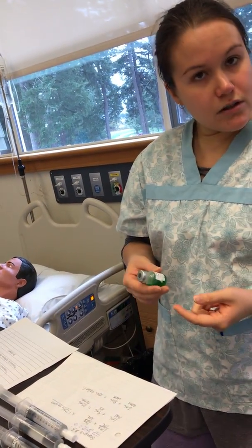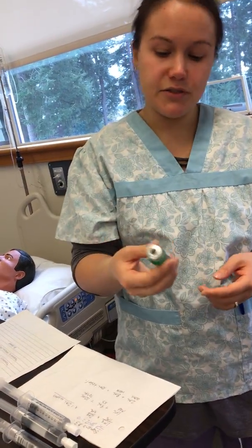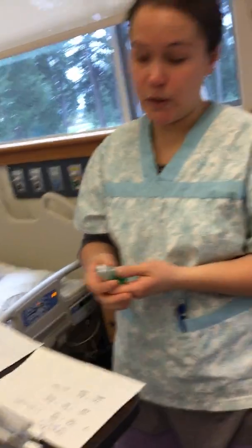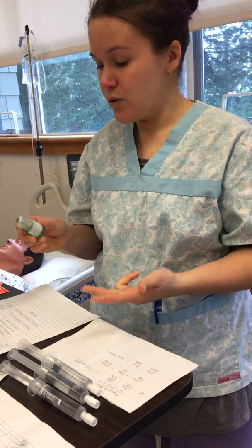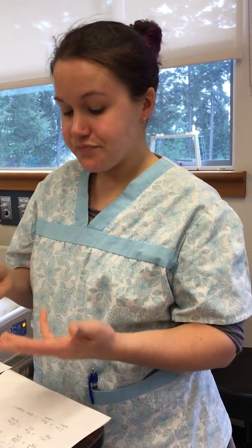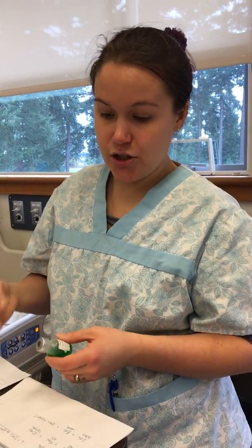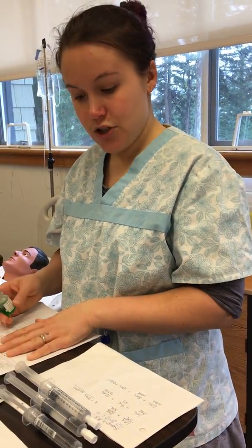It should be an ampule, but there's no more ampules left in the Learning Center, so I'm using a multi-dose vial instead. So we're going to pretend it's an ampule. As I take it out, I do my first set of checks, 7 rights. Patient, Sue Brown. Drug, morphine. Dose, she's going to have 2 milligrams, that's diluted to be 2 milliliters. Route is IV. Reason is for pain. Time, make sure she hasn't had it in the last hour, and she hasn't. And documentation, make sure that it's on my MAR, my other documentation.